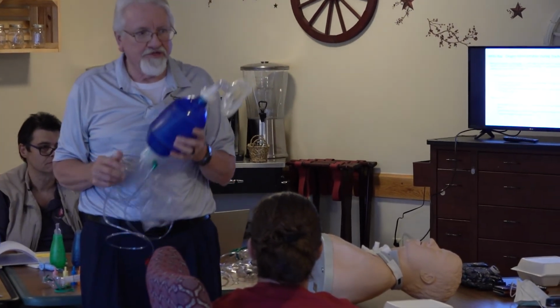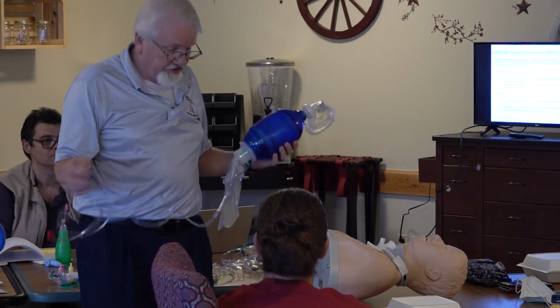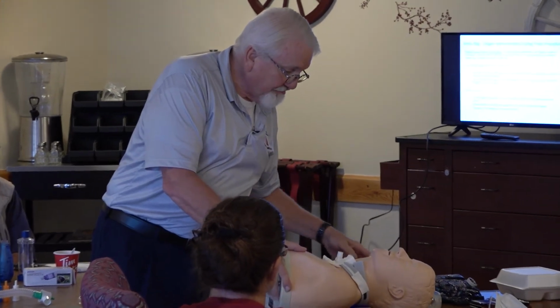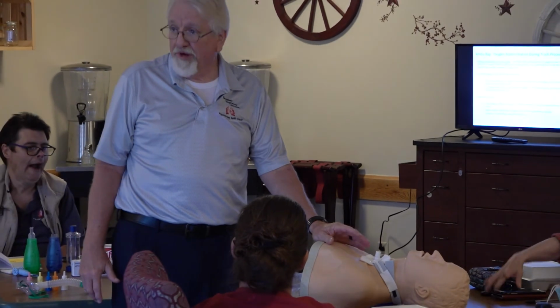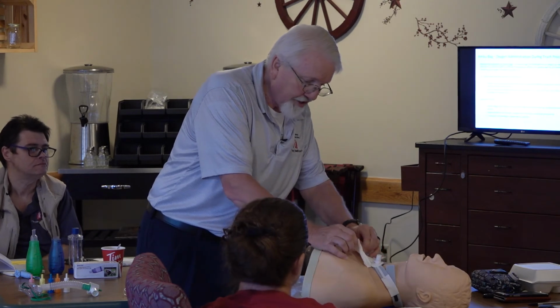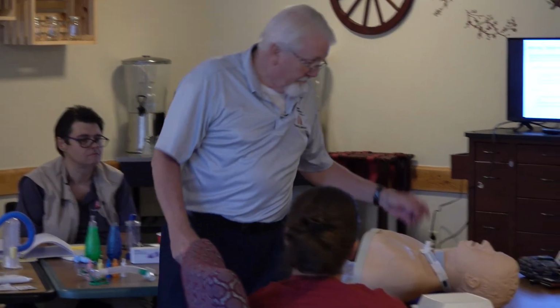One, you're going to give the same breaths as you would in normal CPR. The difference is how you're going to use this little device in doing it. So it's going to be hooked up to your oxygen just like the other. So the first example is we're going to do Bob, who has a cuffless trach, just like he does right here.